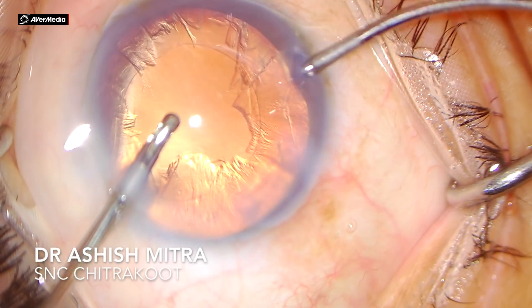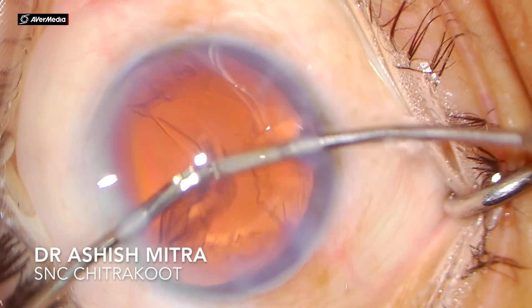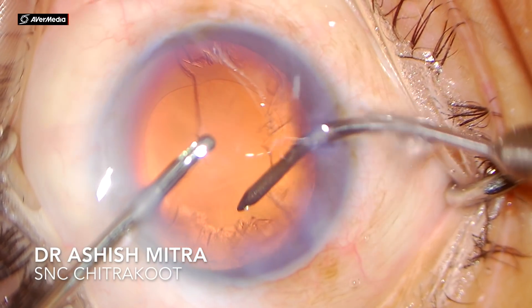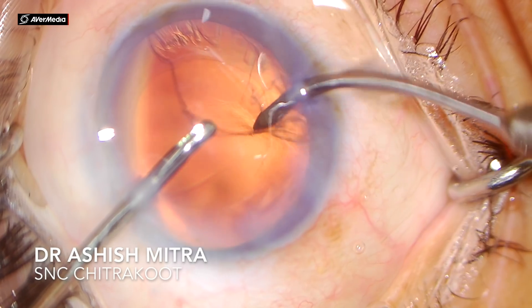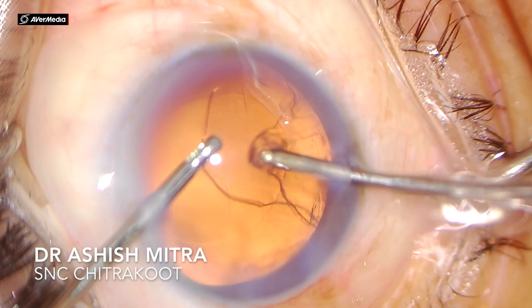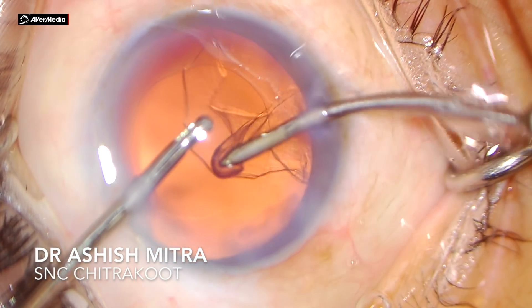Irrigation and aspiration was done. As I always highlight, you have to hold the cortex, feel it towards the center, and then aspirate — that way you are safe. If you are inadvertently holding the capsule, you will feel the traction and can release in time.